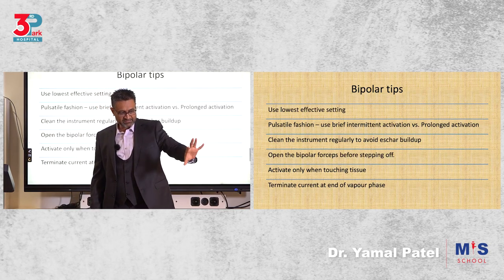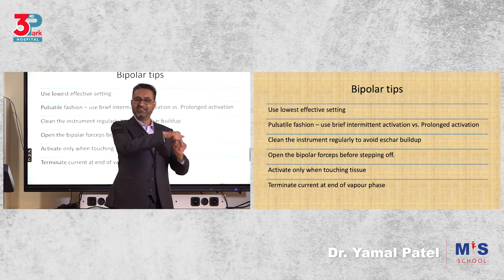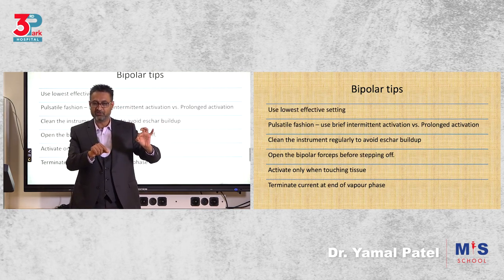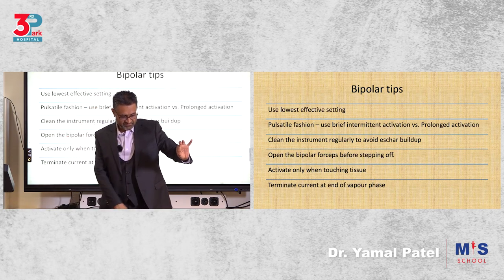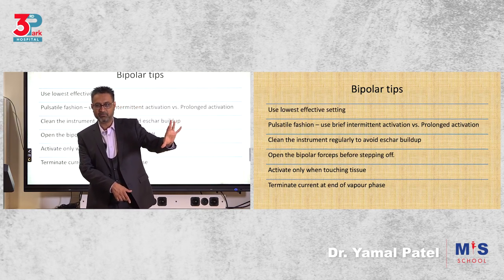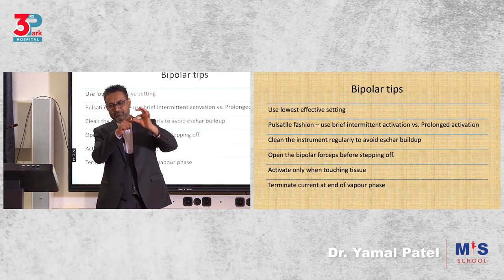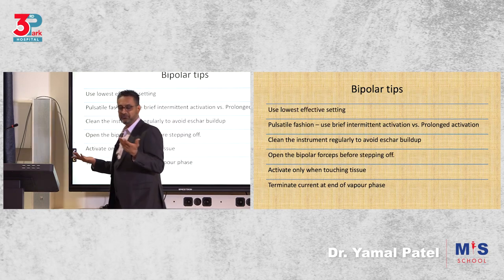Why? Because when I release this first, there is still steam. So steam will not allow my tissue to stick to the instrument. When I release this first, this hot instrument will stick to the tissue because the steam dries up. You've got the point? So hold, activate, then don't release this. Release this, then release this. Got the point? So simple small tips. You will not need to clean your instrument 20 times. Otherwise, every time it will stick with black things, and you'll be telling your nurse clean, clean, clean. It becomes frustrating.